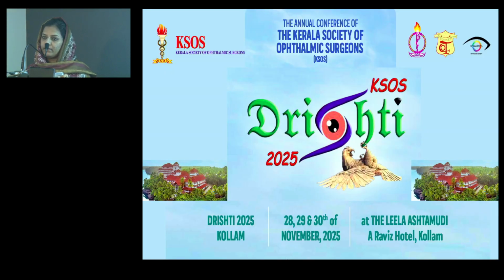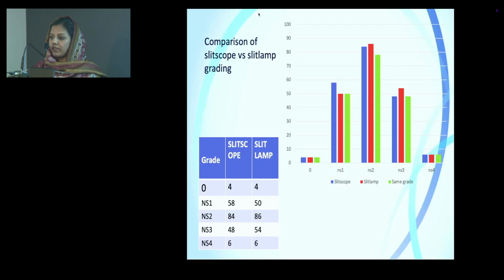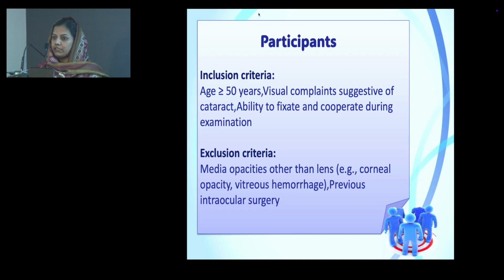Good presentation. Can you please go back to the methodology? Can you tell us who did this? Actually, my mentor invented this and I conducted the study. Who used the slit scope? An ophthalmologist consultant with 5 years of experience, to ensure accuracy, reliability, and to minimize inter-observer bias.